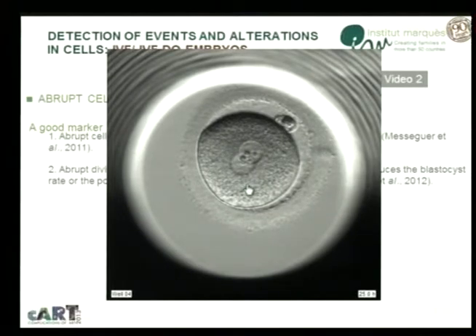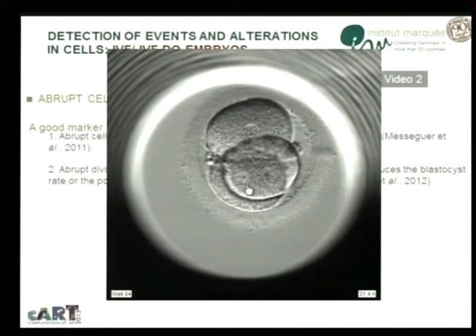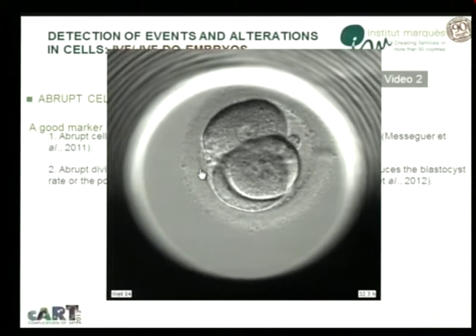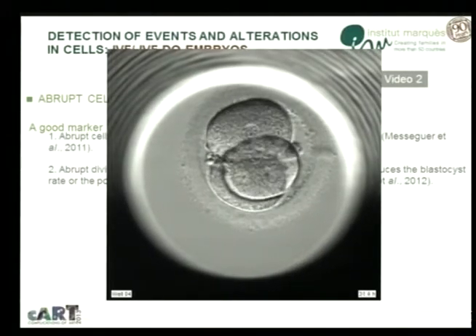You will see here the start. Let me show you first. You have 3 cells here, and if I play it again, you will see that there is no line between 1 and 2 cells. It goes directly to 3. I play it again because it's too quick. You go from 1 directly to 3. Obviously, in the lab, we don't check the images as quickly as this. You have to check it slowly, and you can stop it, and you have to check it in a different focus plane all the time.